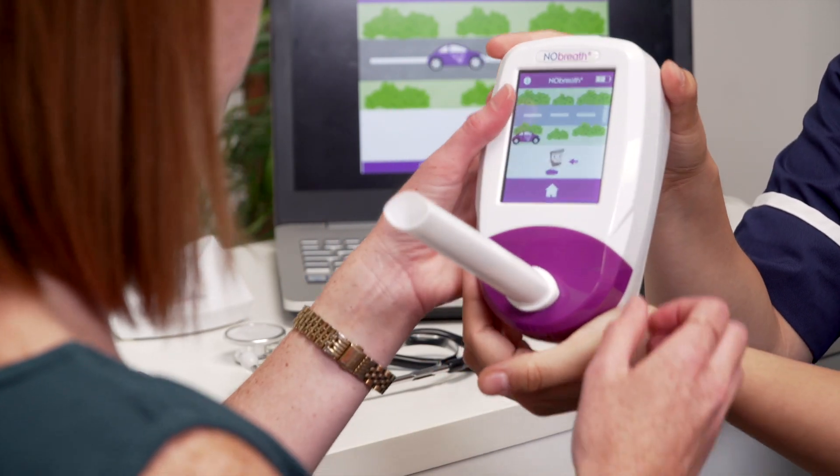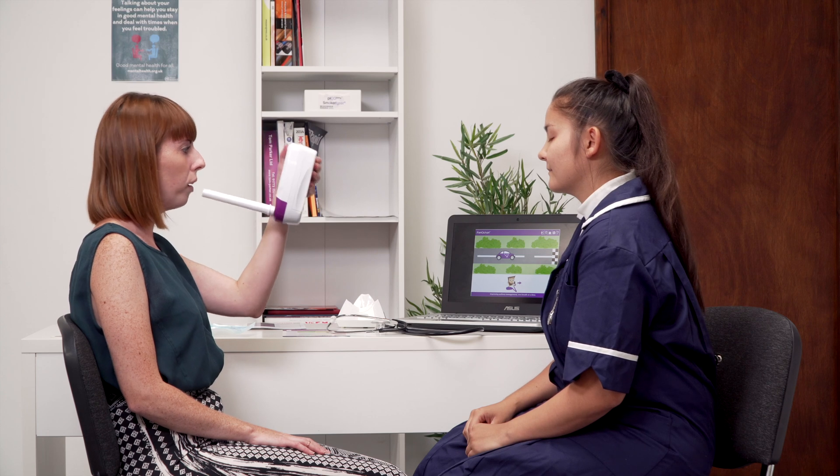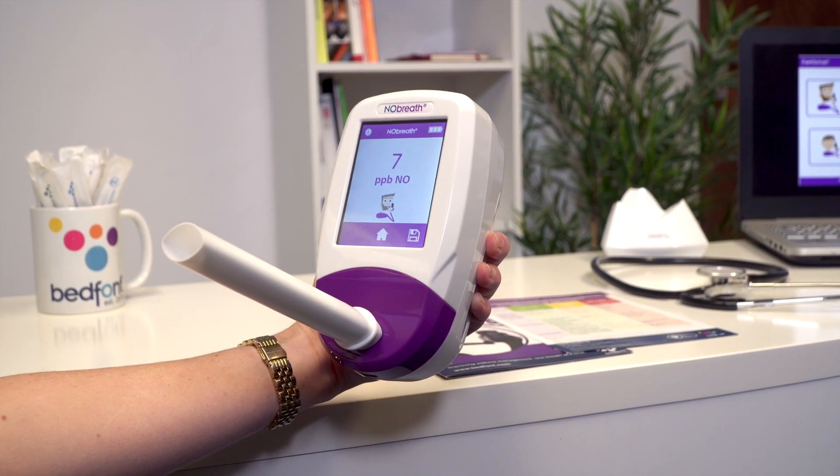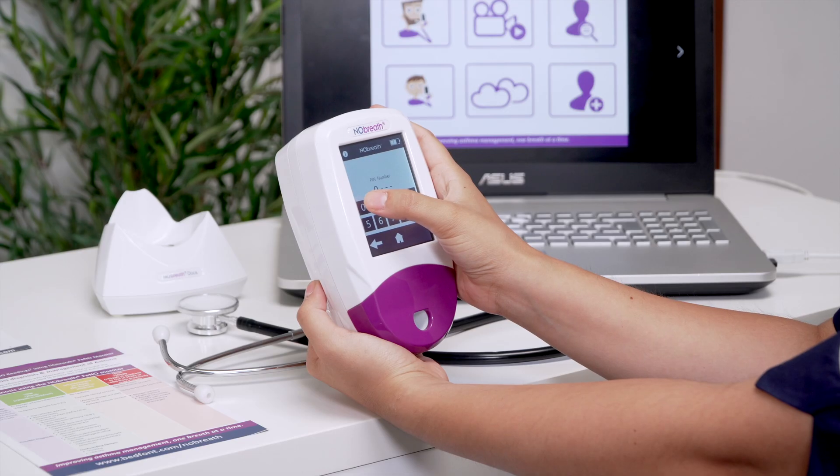You can press the home icon to return to the main screen, or you can save this result by pressing the save icon. If you choose to save your results, you'll be asked to enter your PIN if you haven't entered it in the last 30 minutes.